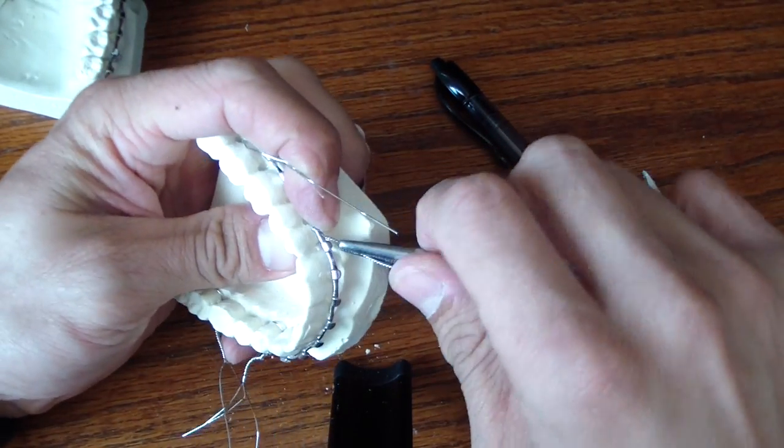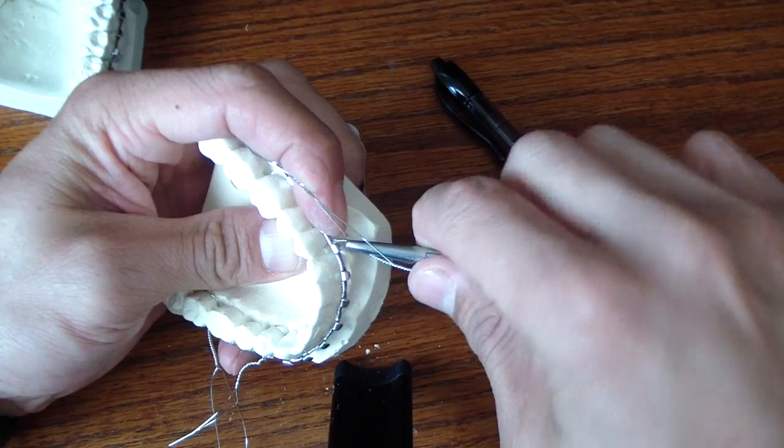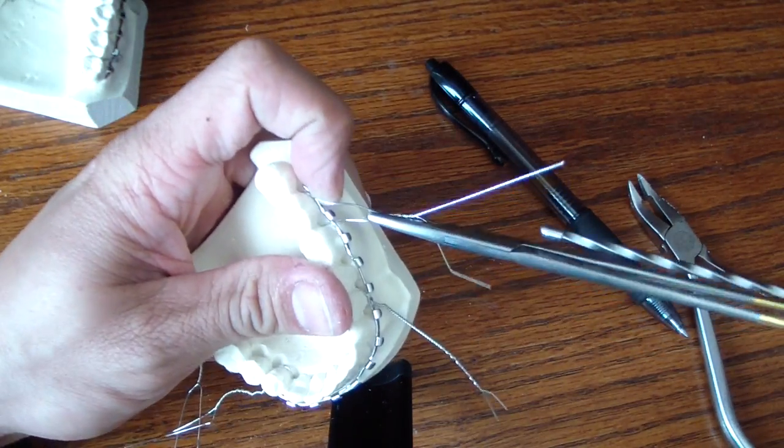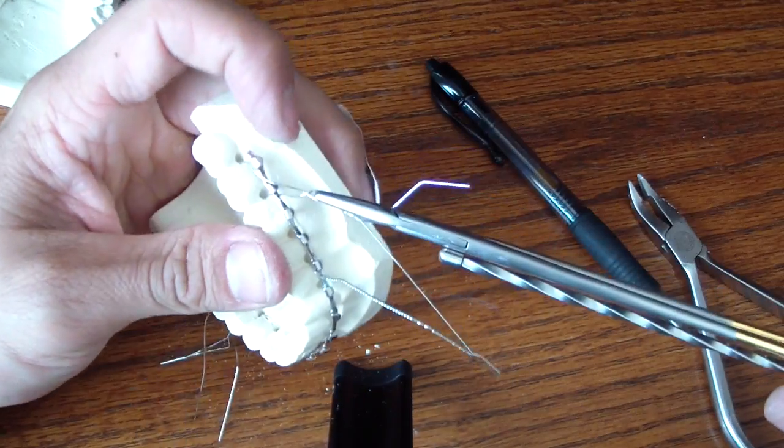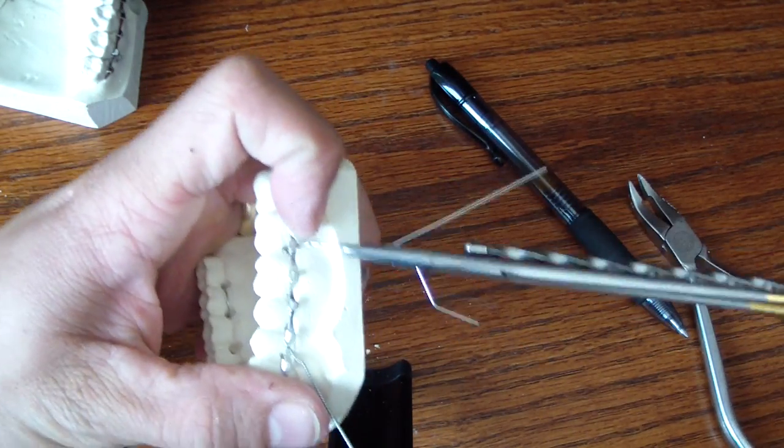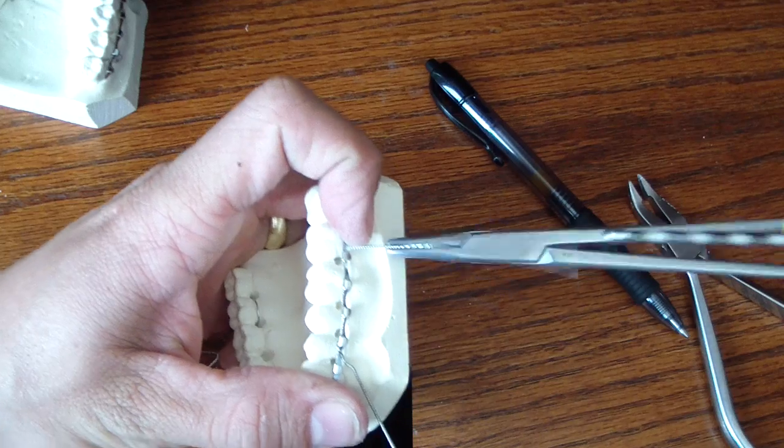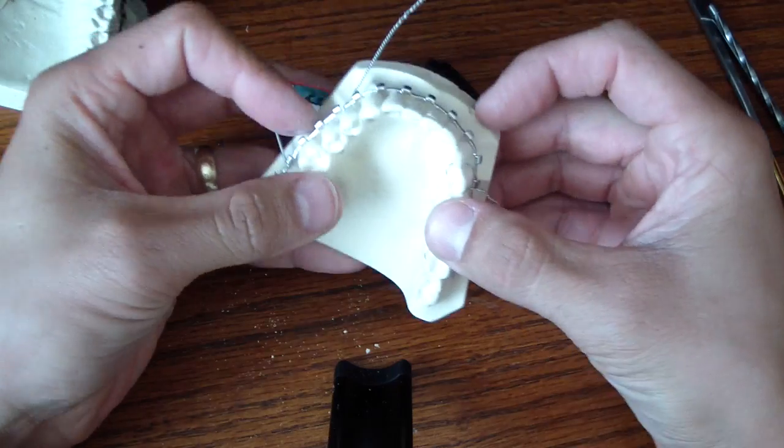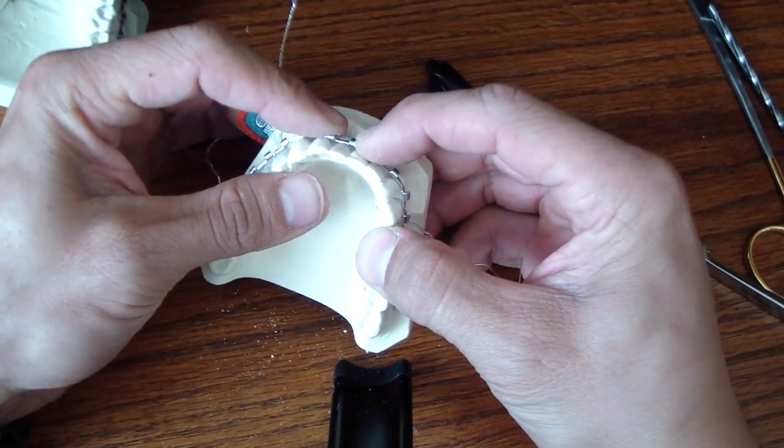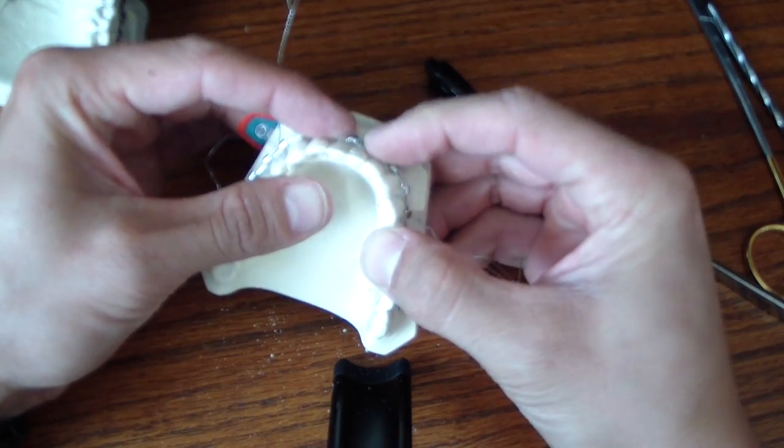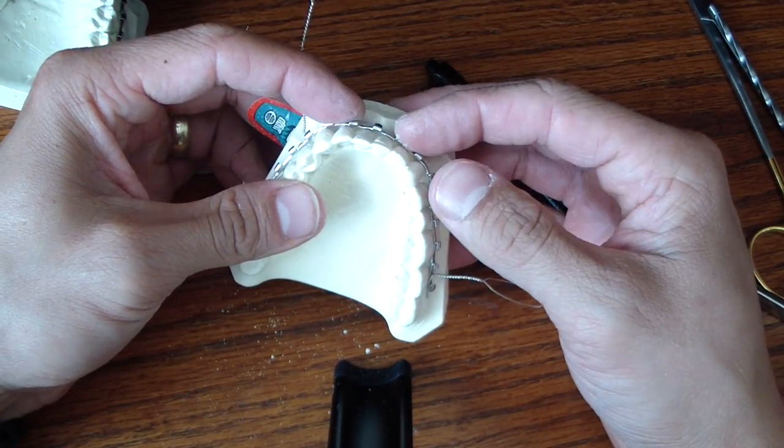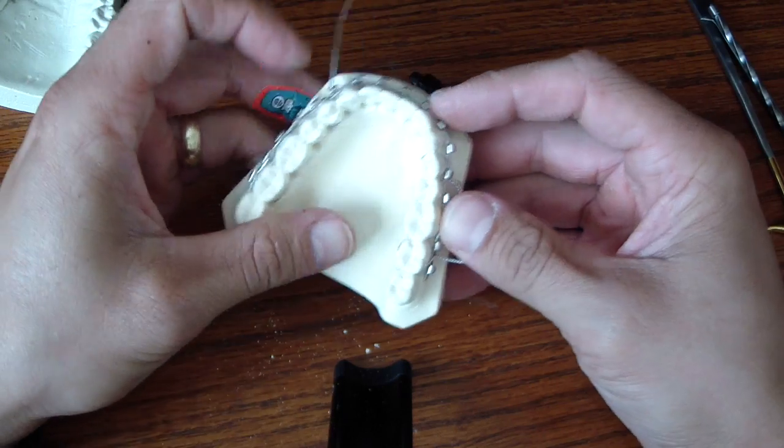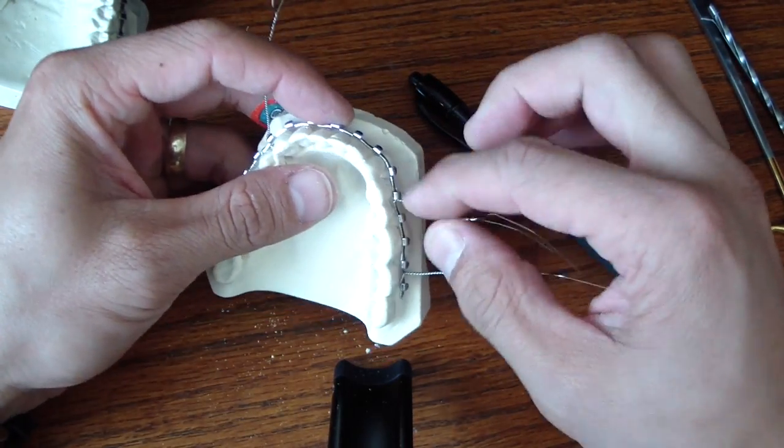One of the key things is to try to keep the lugs clear of any wire. That will help you when you go to put your fish loops around. See how this is nice and tight. I could have actually put in one here, then gone all the way around. The next stage is now I'm going to put a couple more and then we're going to cut these and then make rosettes.